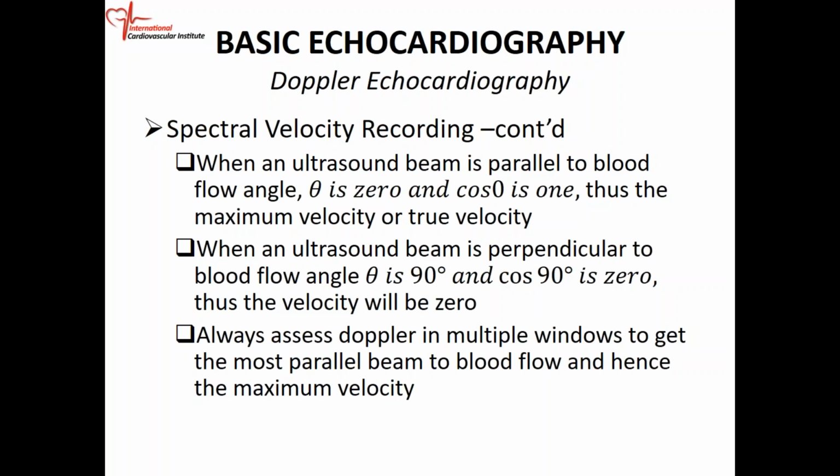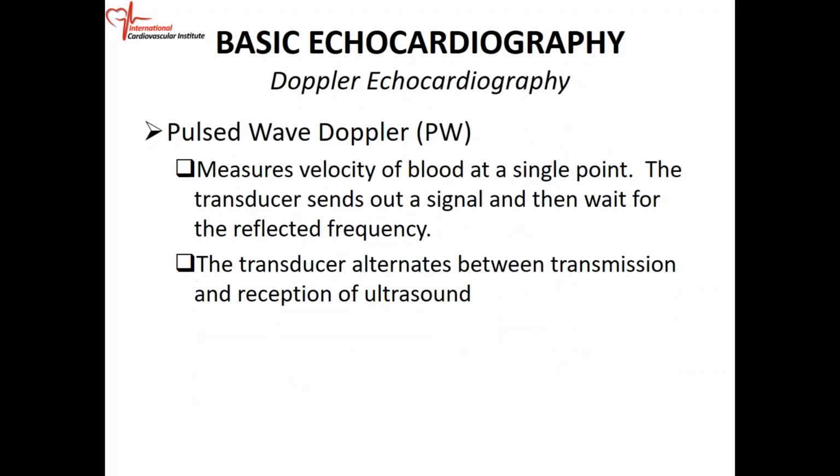And if you're accustomed to doing it in just a couple of windows, that might not be the window that gives you the most parallel ultrasound beam to blood flow. So use multiple windows to get that parallel ultrasound beam to blood flow.